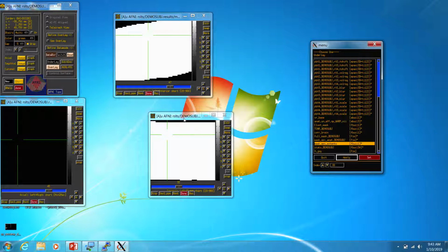But what happens is in our EPI data, only a certain number of voxels are active for our subjects. Stuff outside the brain, there's often some values of 0. And in our analysis approach, what ends up happening is if you have a value of 0, that voxel doesn't exist. And if it doesn't exist in one person, it doesn't exist in your whole sample.